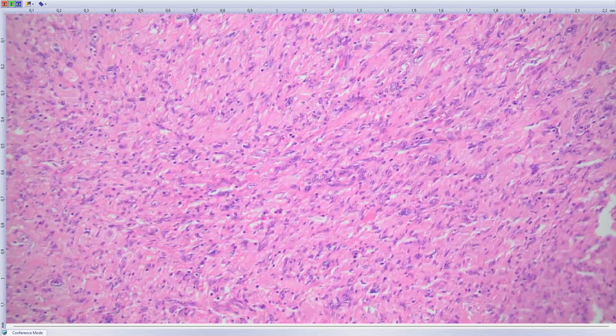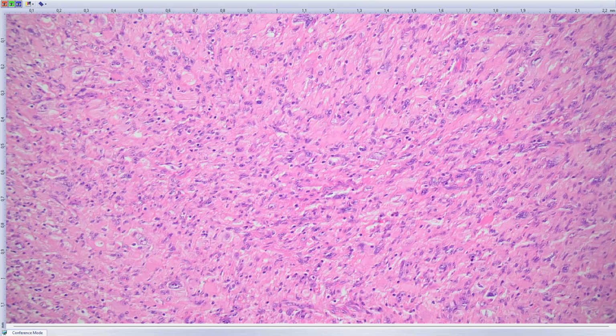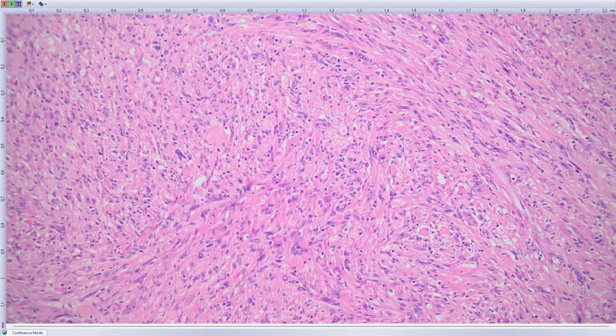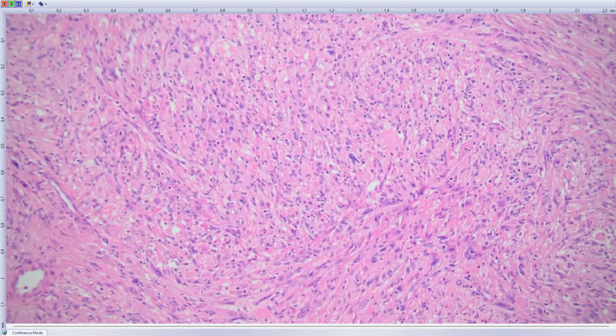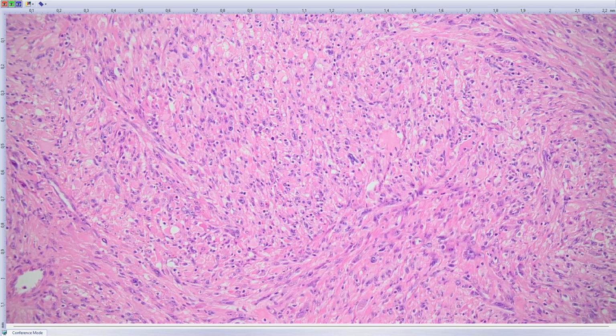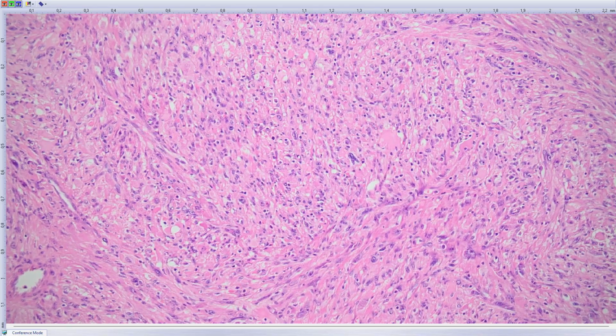One more important thing I forgot to mention: these tumors are very atypical, very pleomorphic, but they are generally indolent tumors. Out of about 40 cases published with follow-up, only one metastasized. And the clue that this is not a high-grade sarcoma is that you basically don't see, or rarely find, mitotic activity.